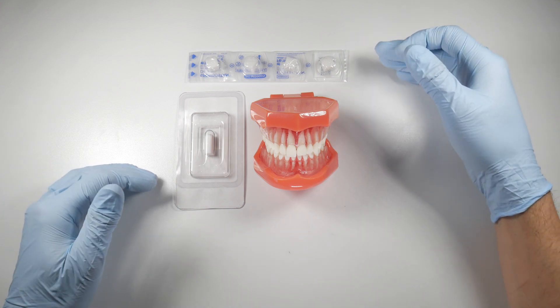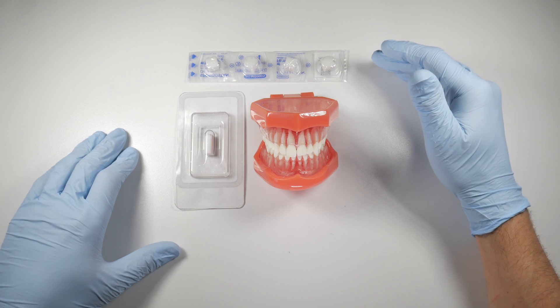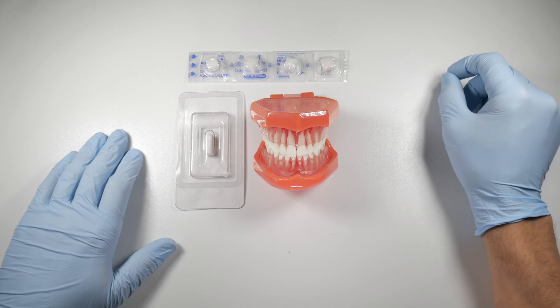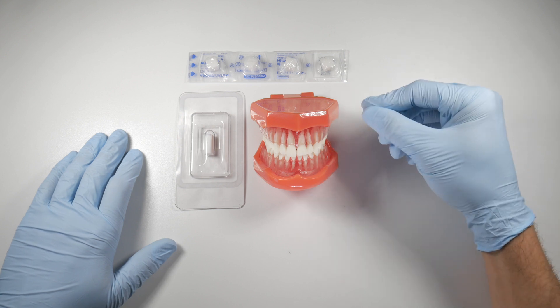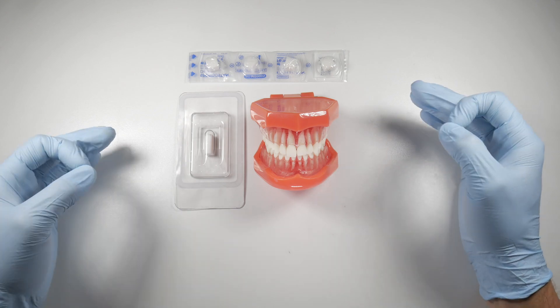If you prefer gel foam and have topical thrombin in your office, gel foam can be used in combination with topical thrombin. Dip it in the thrombin, squeeze it out to remove air bubbles, then resaturate it and place it within the socket. This will dramatically speed up the clotting process.